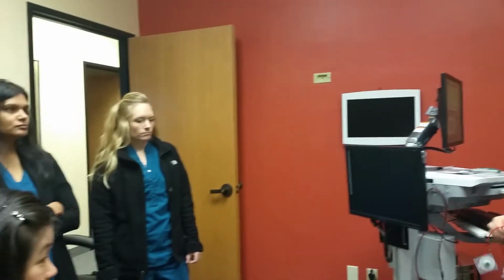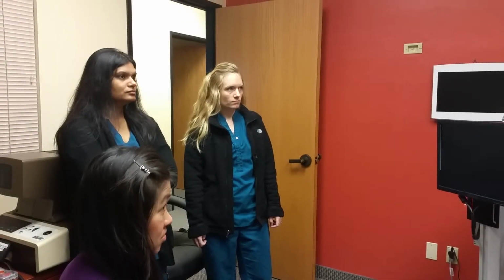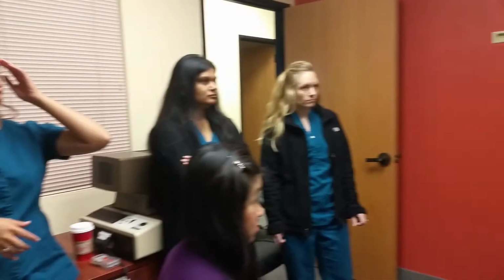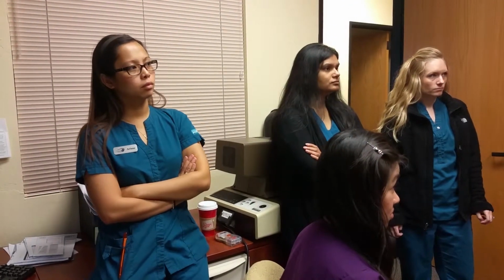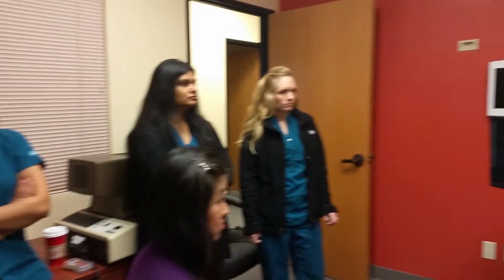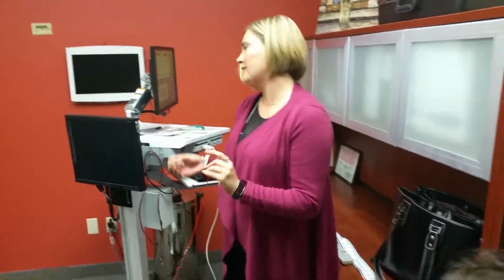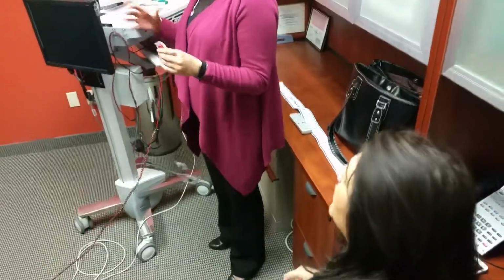You also do not want to test them in their glasses. If your patient has a bifocal add in their glasses, even if you can trust your patient to look through just the top portion of their glasses, the whole bottom part of that screen is going to be completely distorted because of their add. That's also going to mess with your test results. So you always want to make sure that you're doing everything you possibly can to make sure that your patient has the best possible testing environment for them to do better.